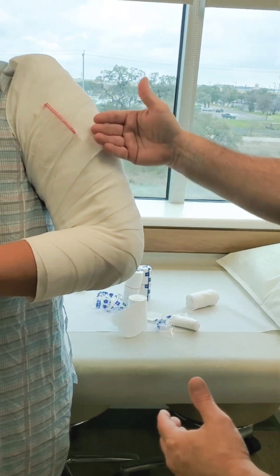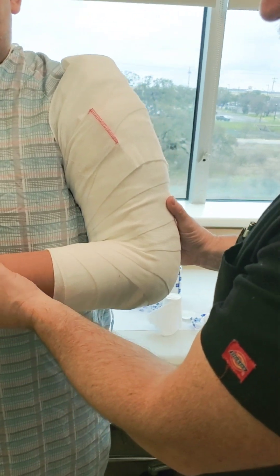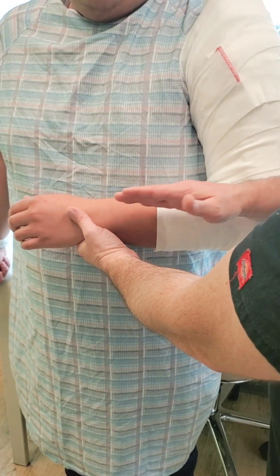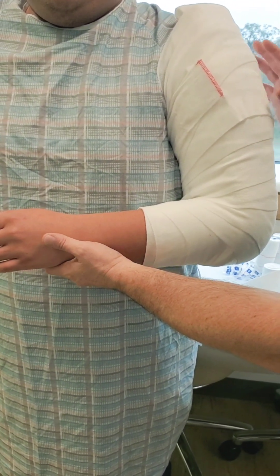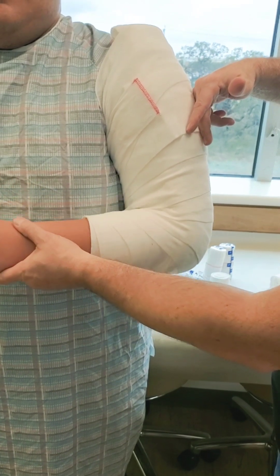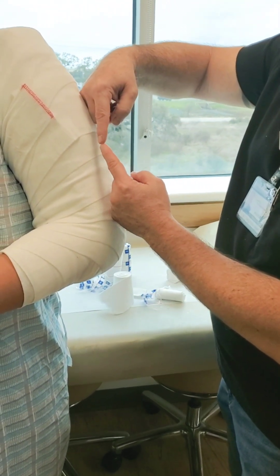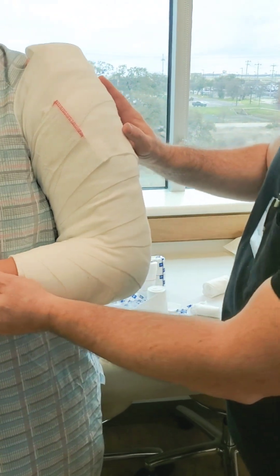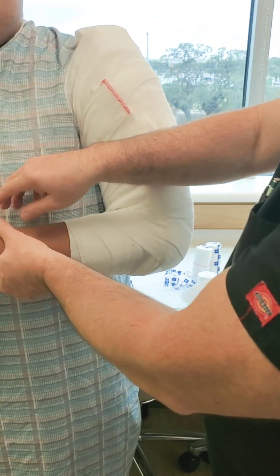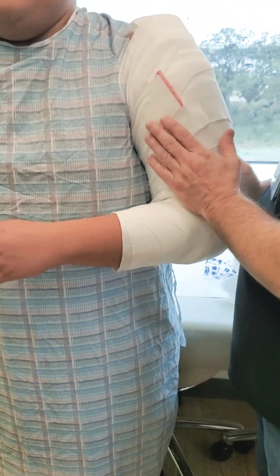With just a few minutes of wrapping, it's already getting hard — you want it nice and hard to protect that humeral fracture. The doctor will more than likely order a sling. When putting the sling on, make sure the arm is in a relaxed position, usually across the belly. In a typical humerus fracture, bringing the hand up too high increases the risk of separating the fracture; too low changes the shape of the coaptation splint and may shift the fracture. Ask the patient where it's most comfortable as you cinch and velcro the sling — wherever they say is most comfortable, that's where you secure it.